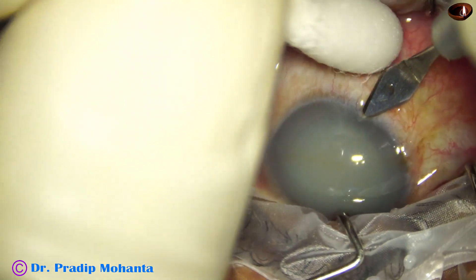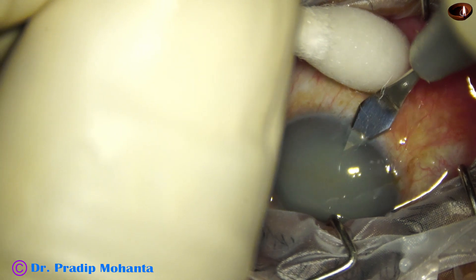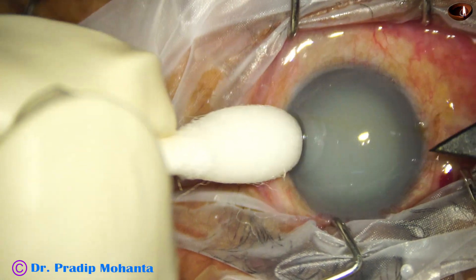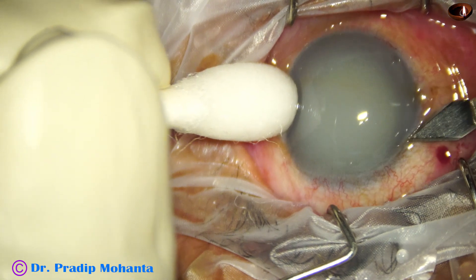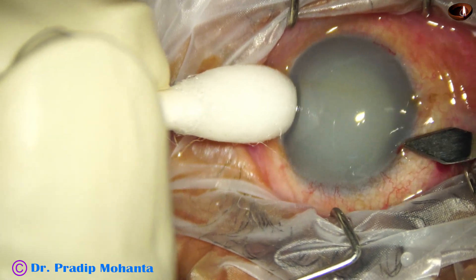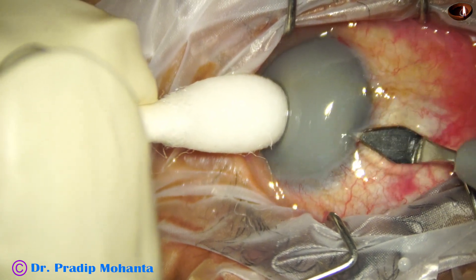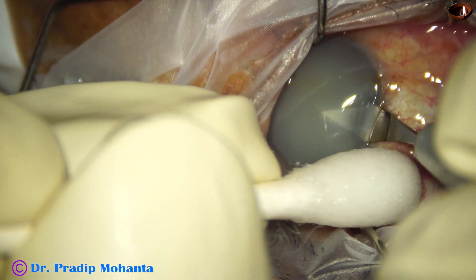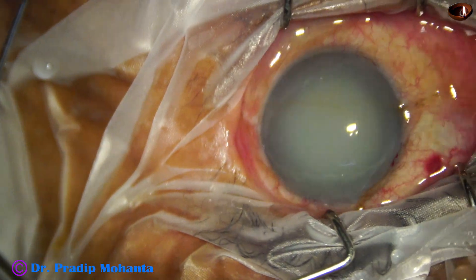This is a sideport made by the keratome itself at around 8 o'clock. Then the main incision is made by the keratome at 11 o'clock. This is a triplanar incision with a steel keratome, and the incision includes some capillaries.